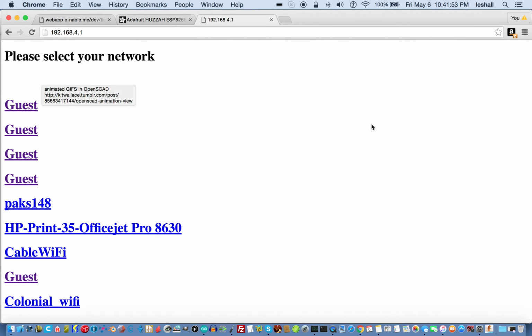This web page here is now the front end for the chip. It could be your phone, it could be your tablet, it could be your Mac, PC or Linux, any device that has a network and a web browser can be the front end for this chip, and the chip is going on the prosthetic, so the prosthetic can have this front end.